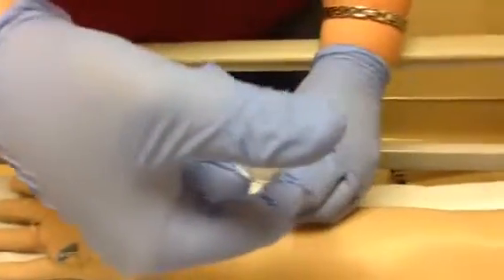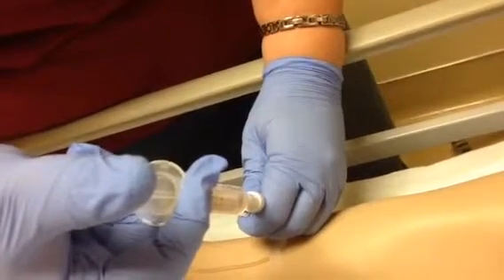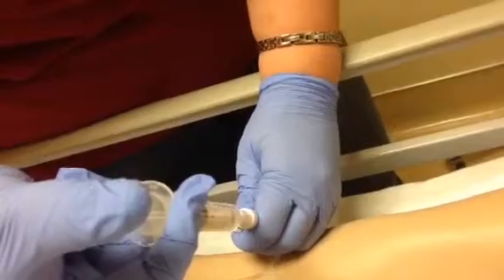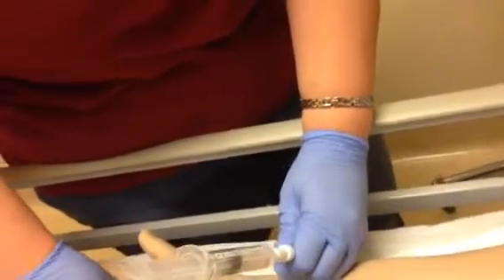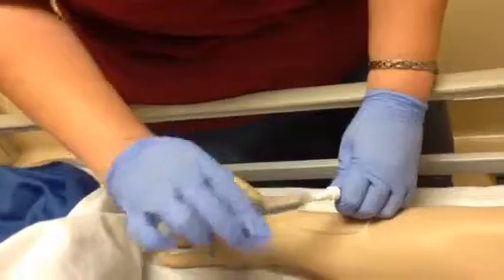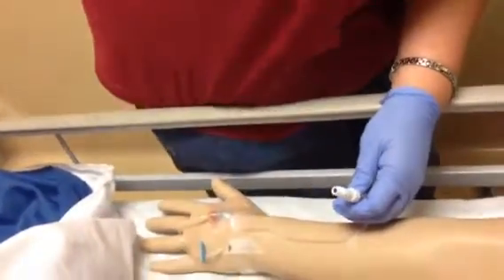And now I'm going to flush 3 milliliters of saline just to make sure it's patent. Okay. Okay, so it is patent. Alright, I'm going to set this to the side.